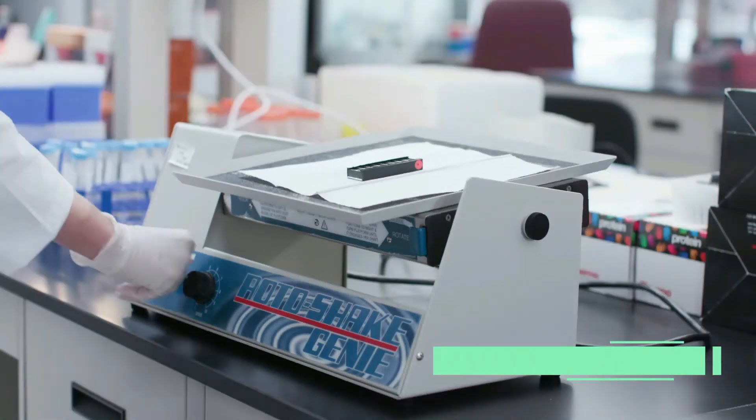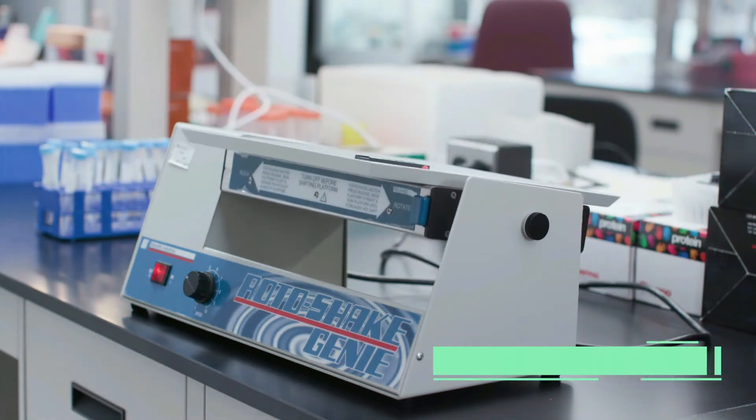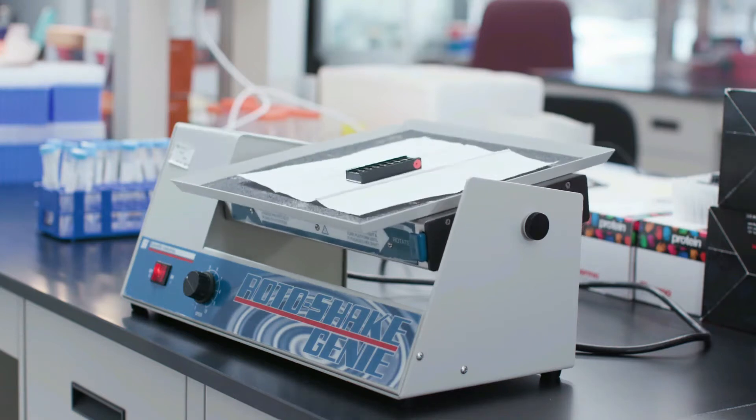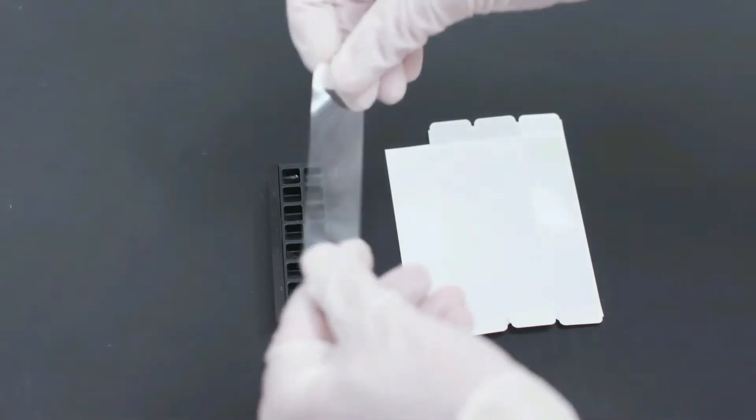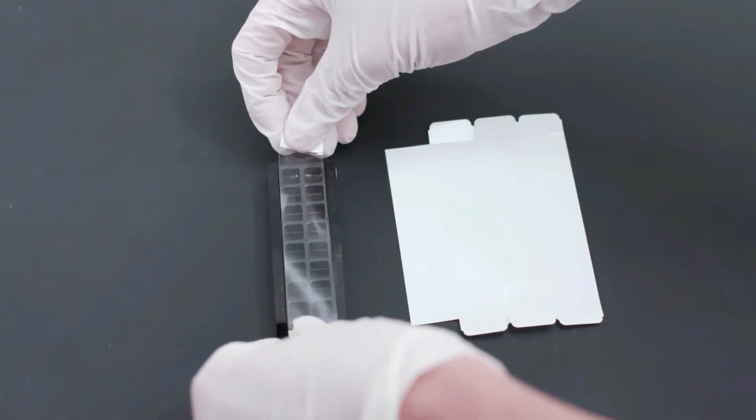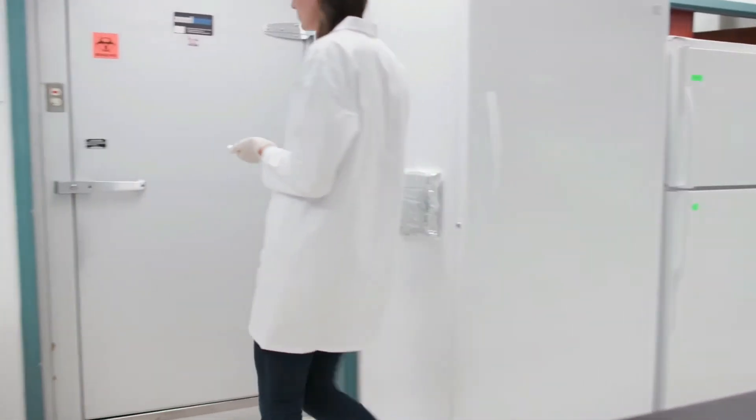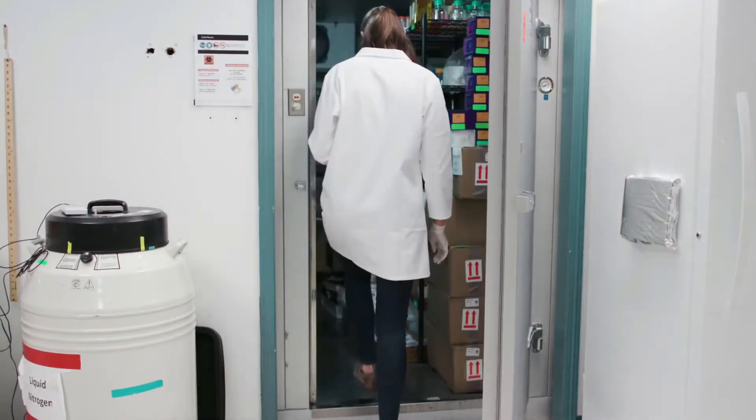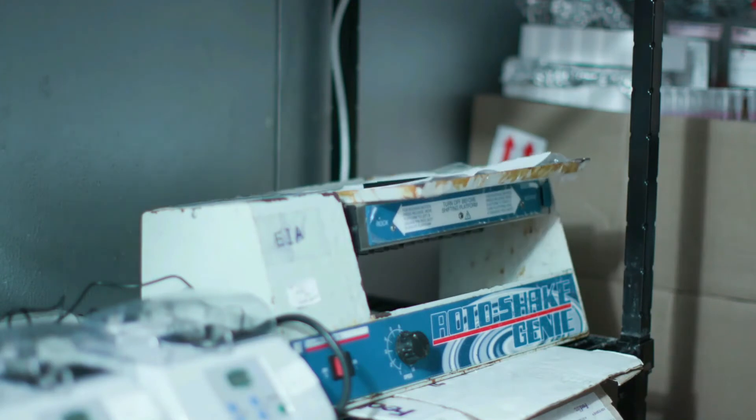All incubation steps, including washes, should be performed with gentle rocking or rotation. We recommend a half cycle per second. Avoid vigorous shaking of the slide, which can cause splashing. We recommend incubation at room temperature. However, the sample incubation step may be performed overnight. Overnight incubation should be done at 4 degrees Celsius, with sealed wells to avoid evaporation. The following day allow the slide to warm up to room temperature for one hour before proceeding with the next step.